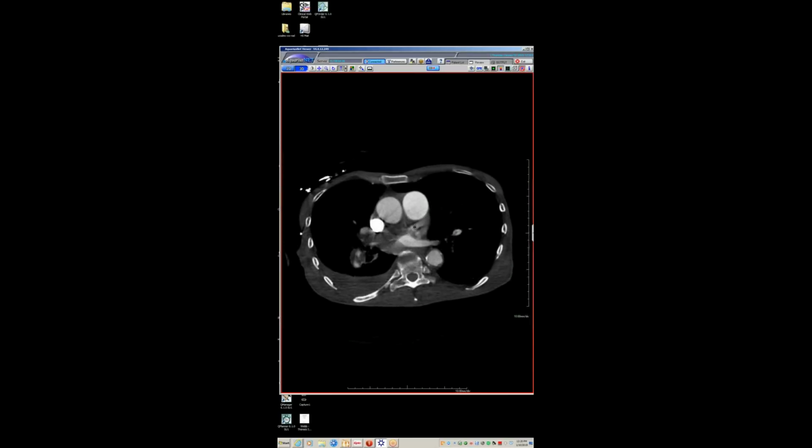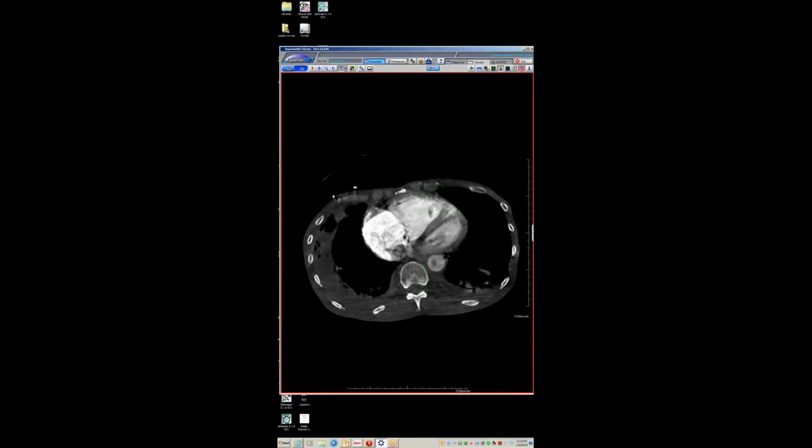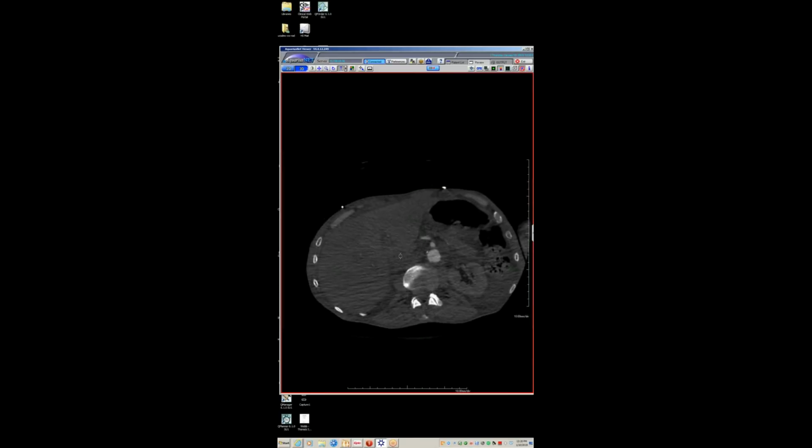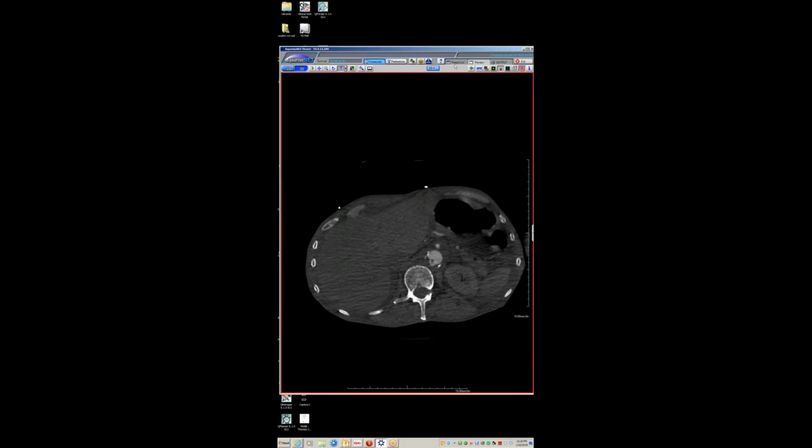And not good that many years ago we called this mixing artifact, because the patient subsequently developed renal infarcts and lower leg ischemia and did not make it. So that was really bad.